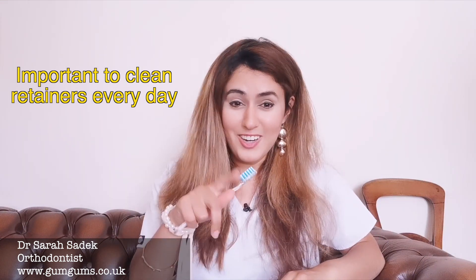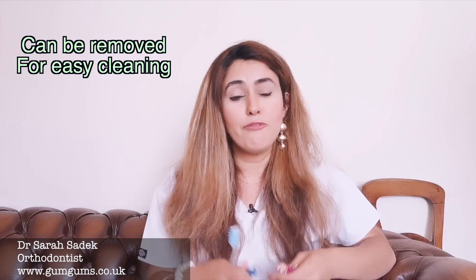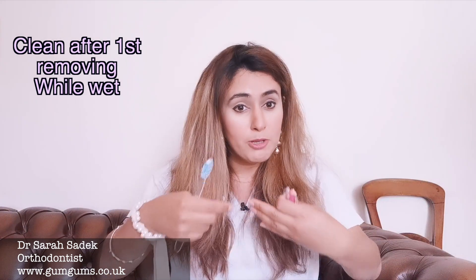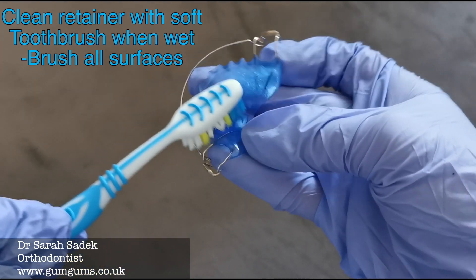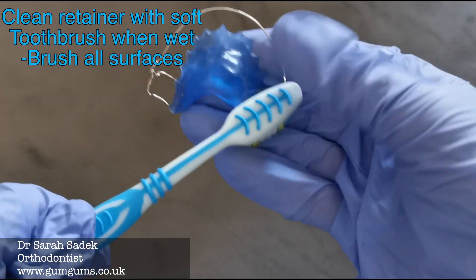So how do you clean them? Both Hawley's and clear plastic retainers are great because they can actually be removed from your mouth to clean, and you need to clean them daily. To clean your clear plastic retainer or your Hawley's retainer, follow these steps. First, make sure you clean your retainer as soon as you remove it from your mouth while it's still wet. This makes it a lot easier to clean off any debris that collects before it hardens. Next, brush your retainer with lukewarm water after each meal. It's a good idea to also brush your teeth at this time.